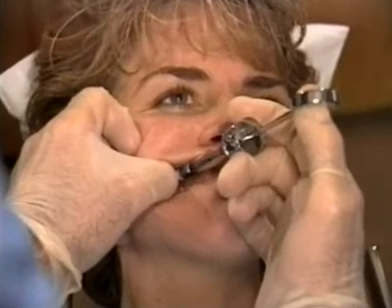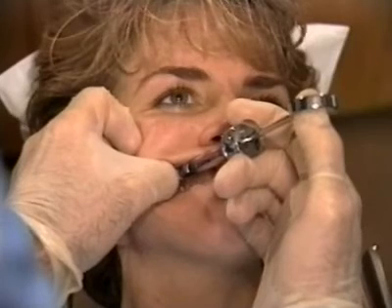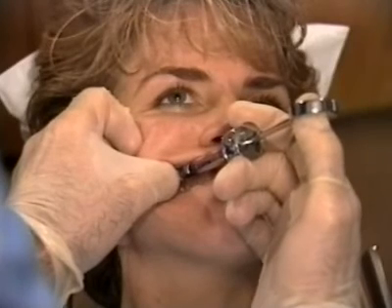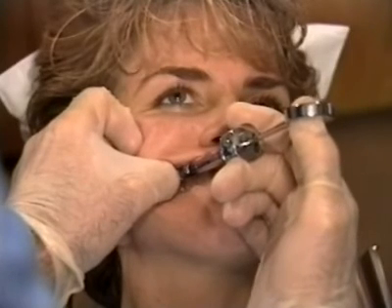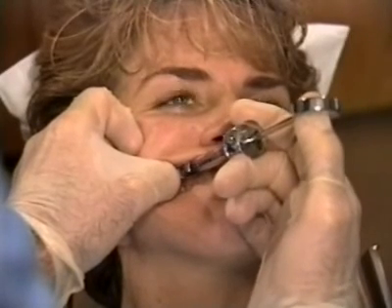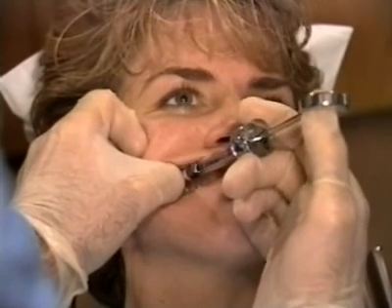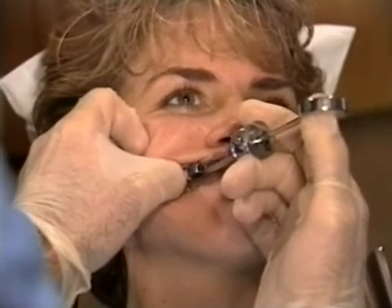When failure does occur, it is usually caused by the needle being angled too medially. The maxillary mucosa is sensitive to abrasion by the syringe as it is advanced posteriorly.